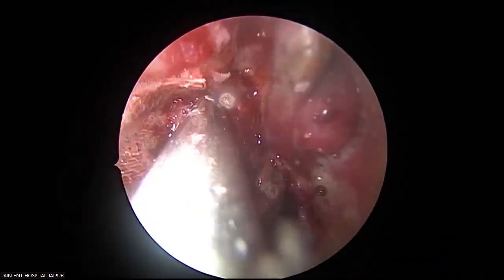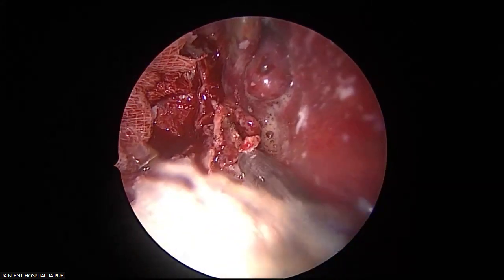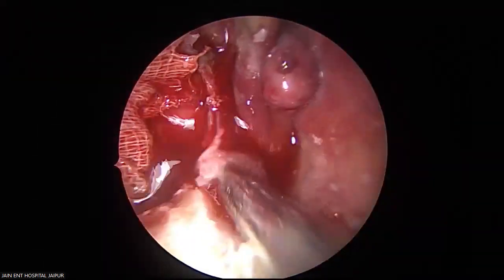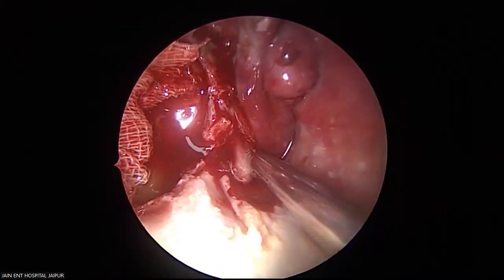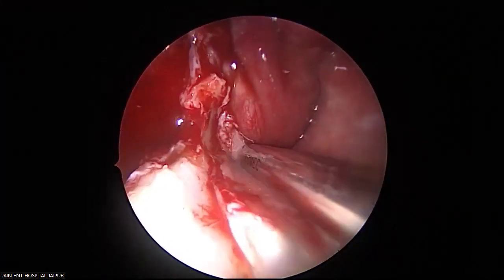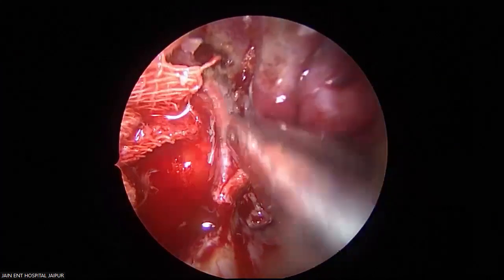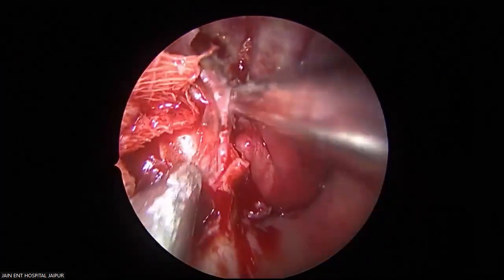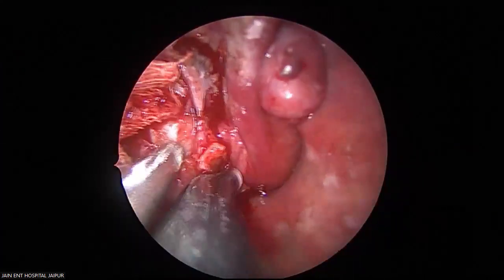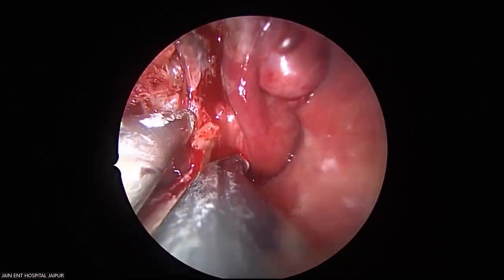Is it very thin? Yeah. Because of the tumor bulge, the wall becomes more and more thin with more and more bulge. See the remnant of the posterior inferior turbinate. See this? Now see more and more tumor surface is getting exposed, and this tumor is involving the middle turbinate. See this involving the middle turbinate?